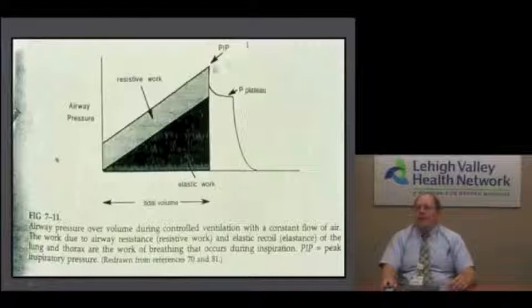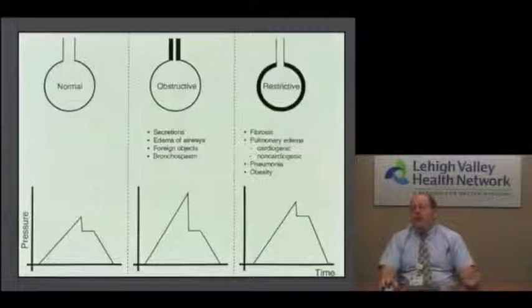And this is a little bit of a picture here saying this is peak airway pressure, this is plateau pressure. So this is endotracheal tube and circuit and airway pressure, but this is what the lungs actually see. All right, so peak airway pressure could be 40, plateau pressure could be 25. Now, if you learn to look at your PIPs and plateaus, it can be helpful.